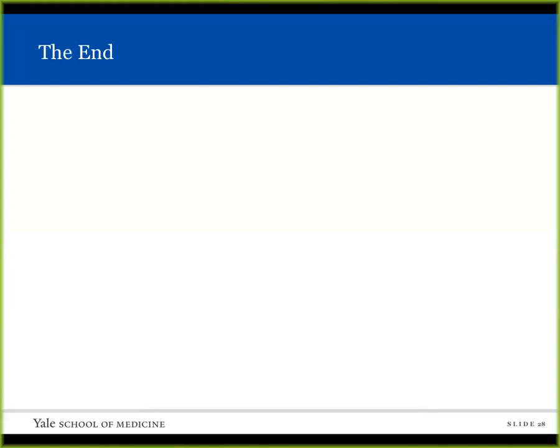The EDGE one wasn't a randomized trial. Yeah. There are dusters and there are basketers, and they're like, this is my practice pattern, and let's see who's better. But there was a 2010 study, the earlier one. I think a big stone is easy to start off dusting, and then once you get down to where it gets really wobbly, it's very hard to dust. So again, I don't know how you could dust a 2 millimeter stone. I mean, you just basket that out. Right.